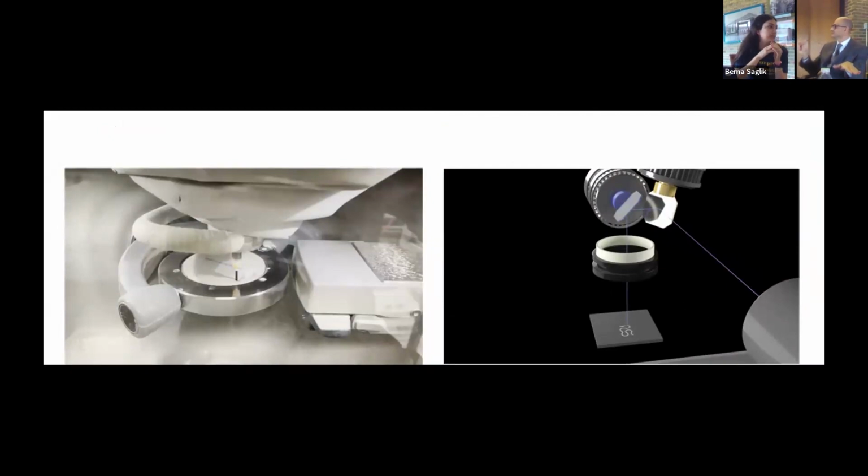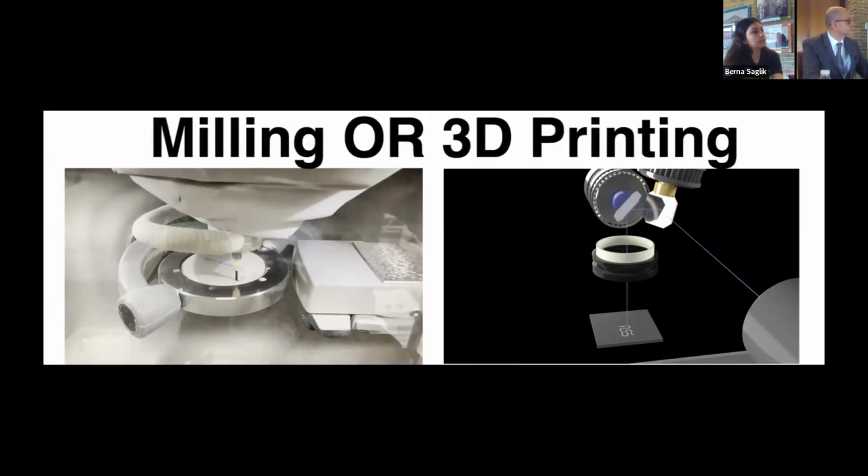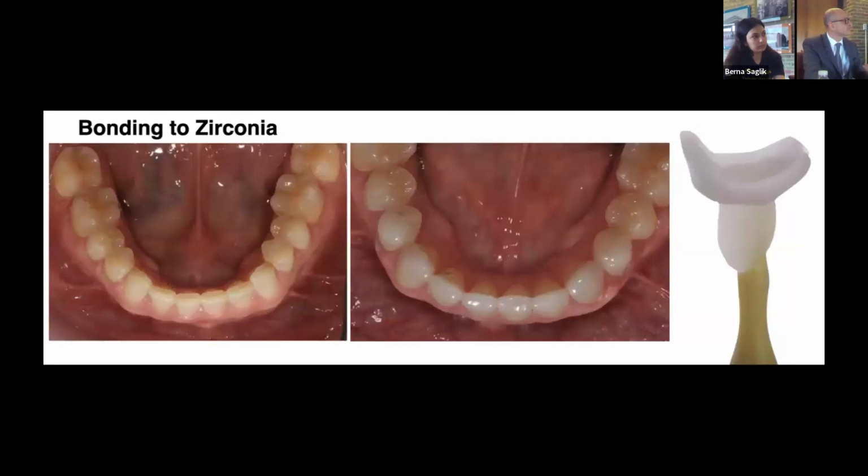However, the second part of my presentation is different. It is about how creative we can be with additive manufacturing. I'm not using 3D printed zirconia because it's stronger than milling, to be honest with you. And I'm not using it because it gives me better marginal integrity. I'm using it because of the properties it gives me, and also I see lots of potential in the future with it. It can do many things that milling cannot do: complex geometries and controlling the biomechanics layer by layer. Let's look at what we can do. The question is milling or 3D printing, so let's see what 3D printing can offer, which I'm very interested in.